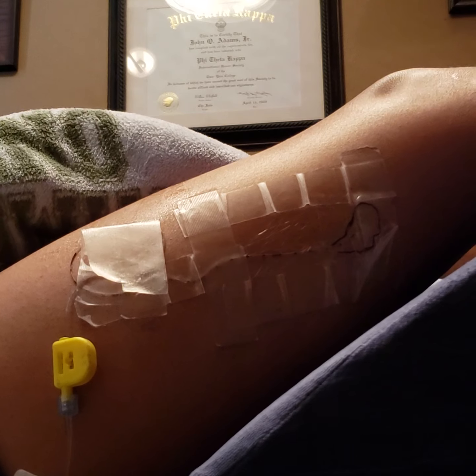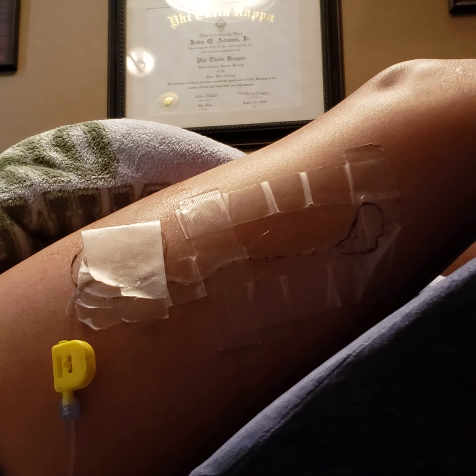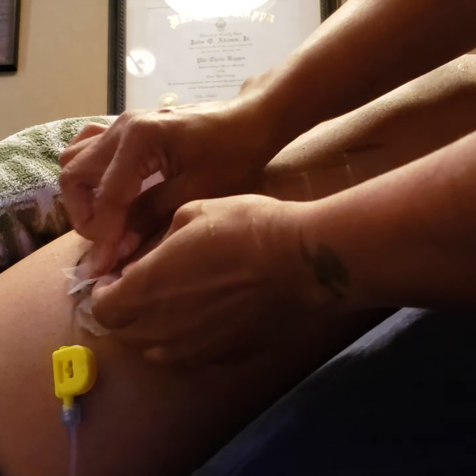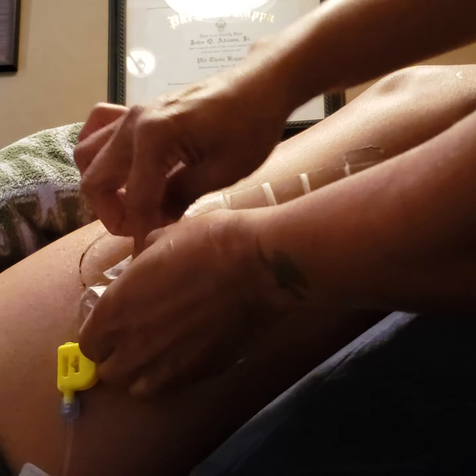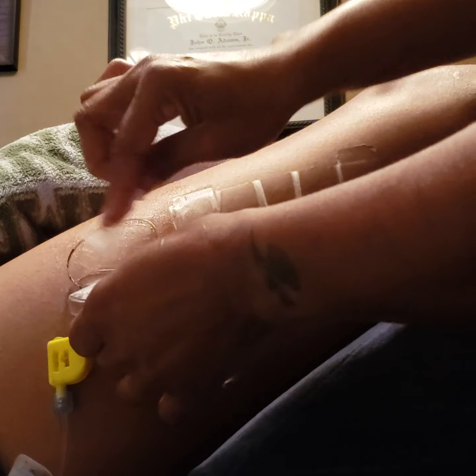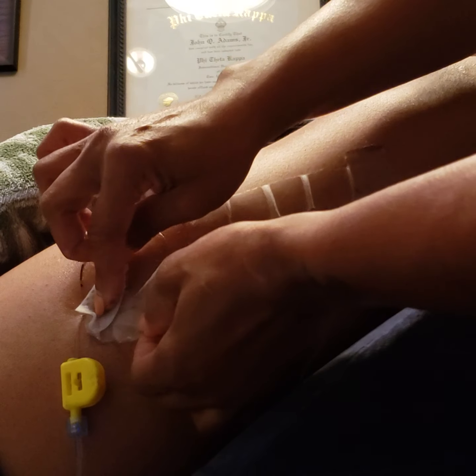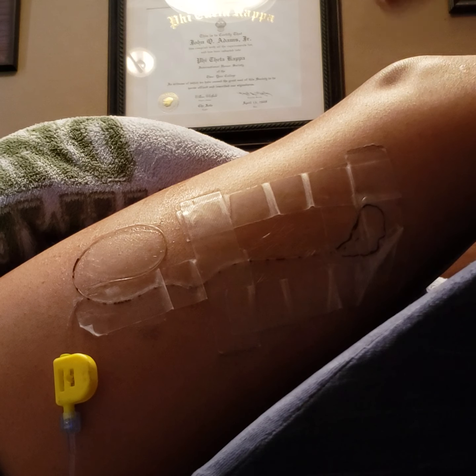You can get these wipes from the hospital or you could just use alcohol wipes because they work just as fine, but it's a big difference — especially for the hairier patients. Just move slow because they will still feel a little bit of pain if you rip it off too fast. That's one piece of tape.